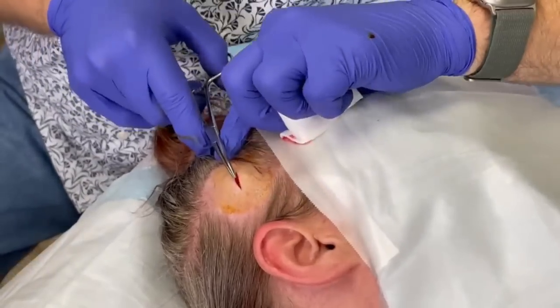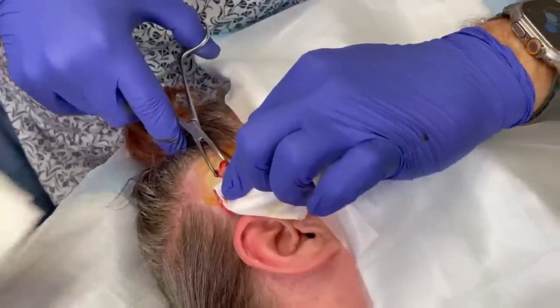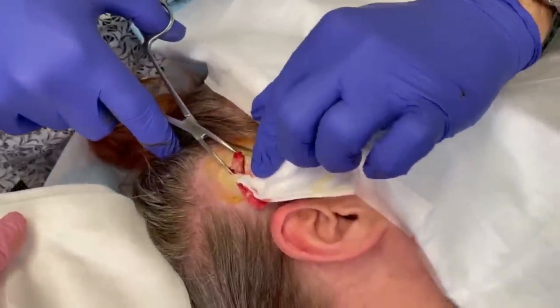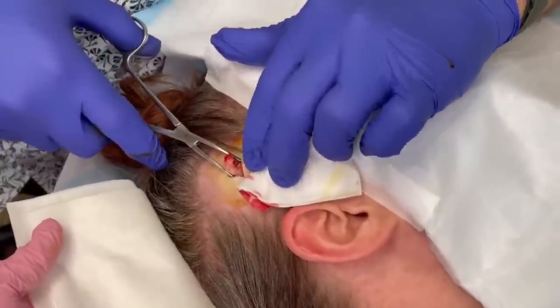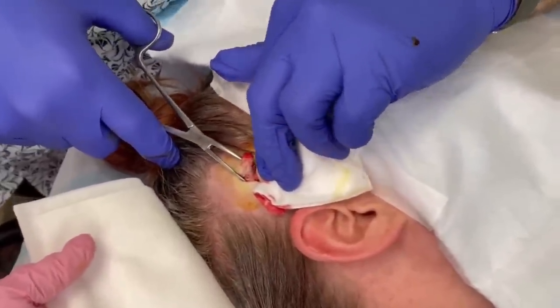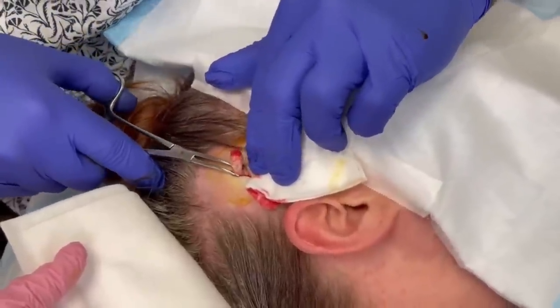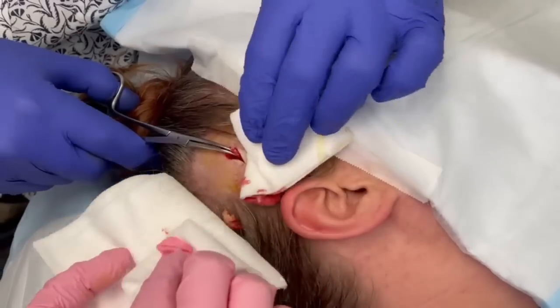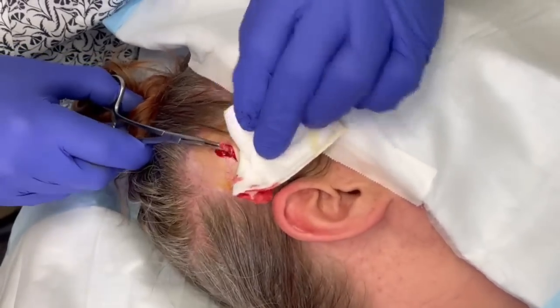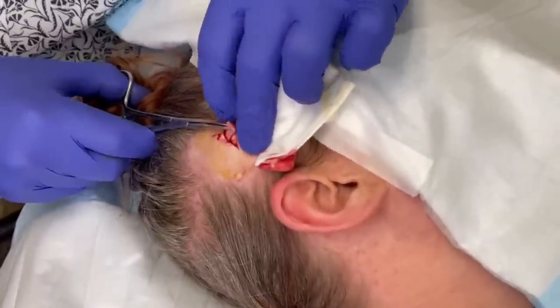Okay. We got a little vessel there, didn't we? Oh, fun. That's okay. Jenny, can you see? Yes. Pretty cool, huh? The baby's coming out. Mm-hmm. I don't think cysts really have a gender like that, Jenny. Okay. Yeah. Thank you. Mm-hmm. My favorite. I just love to pull these sacks out.